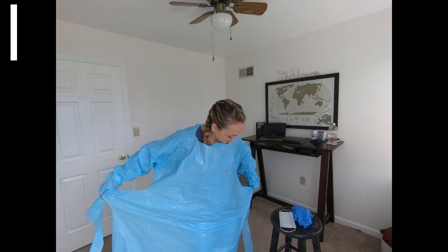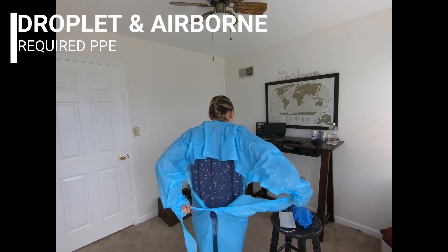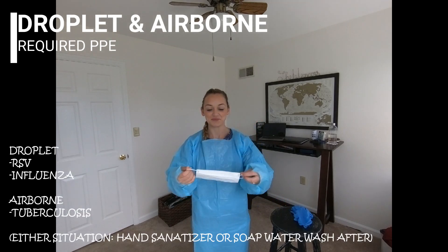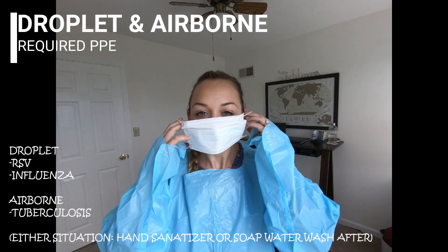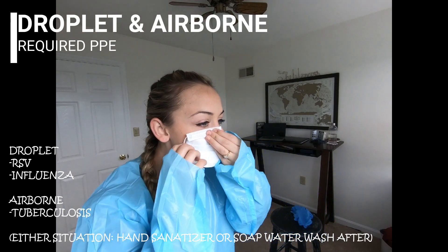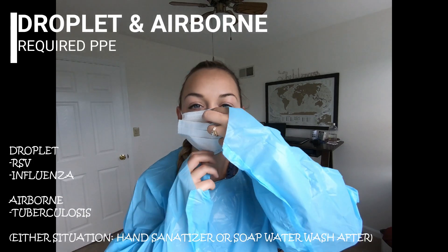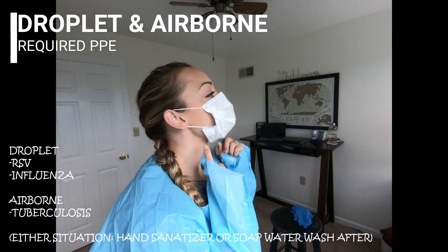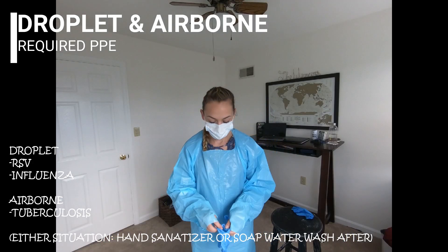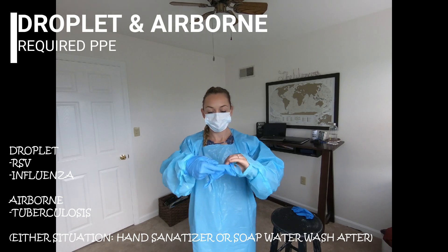Now this would be for droplet or airborne. For both of these, you gown up first and tie in the back. Next, take your mask — this is a droplet mask, which would be for RSV or the flu. First, pinch at the nose, take the earpiece and put it around, then put the other one around. After that, pull down underneath your chin. Try not to have a lot of gapping so the droplets cannot get in. After that, grab the correct size gloves and place those on.